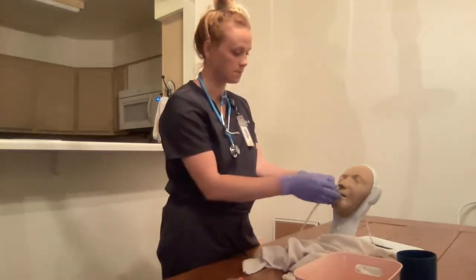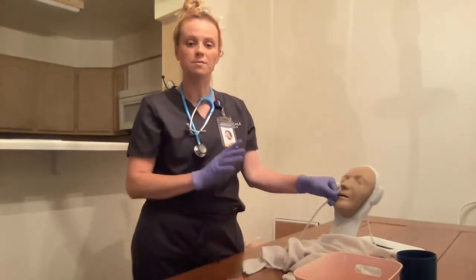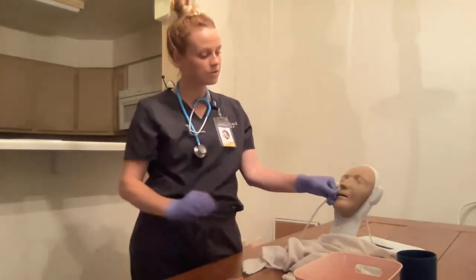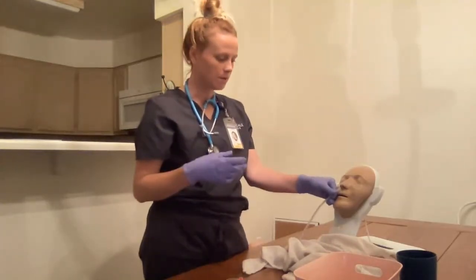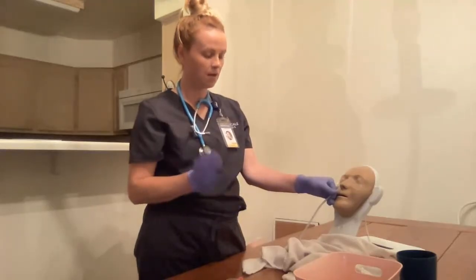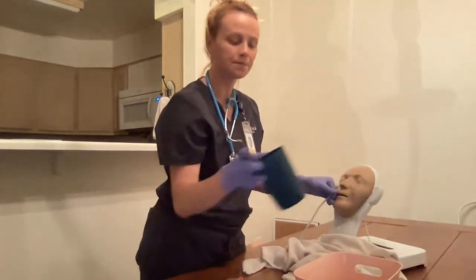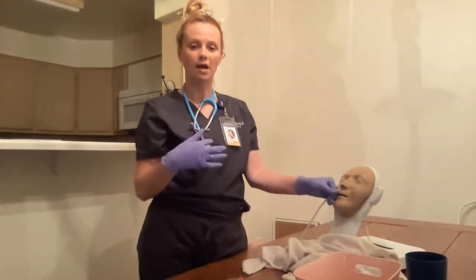All right, I'm going to hold in place here. If at any point during inserting the tube I were to meet resistance, I would withdraw, re-lubricate, and place in the other side. If my patient continued to gag, I would let her rest, take a deep breath. I would give her some sips of water. Swallowing like that helps calm the gag reflex.